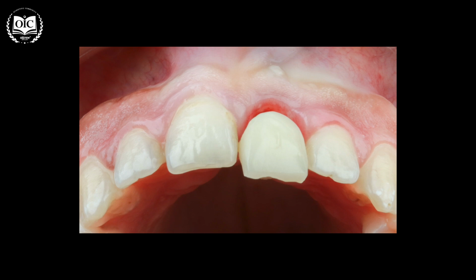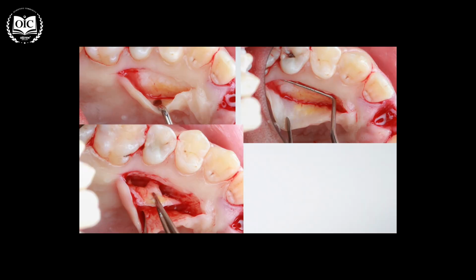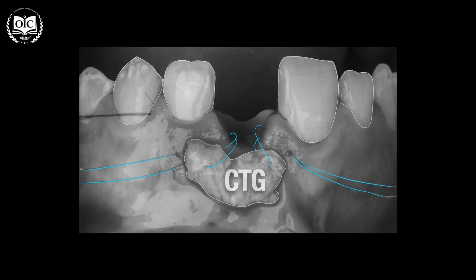Of course, we cannot avoid the crestal bone loss that happens after tooth extraction, but we can compensate for this by adding more tissue from the palate, preferably a deep tissue, to prevent much scar formation in this area. We tunnel a partial thickness tunnel, place the soft tissue graft, maintaining the papilla and the margins in the same place.